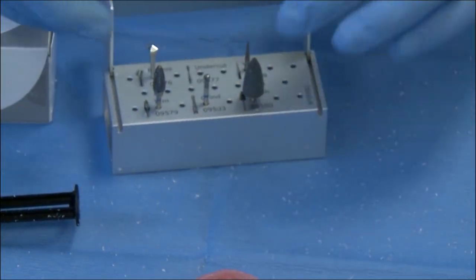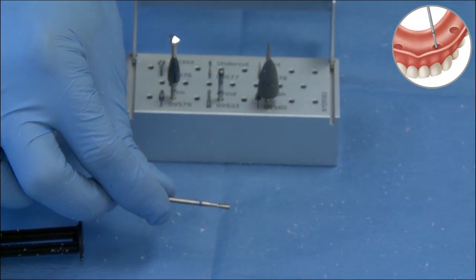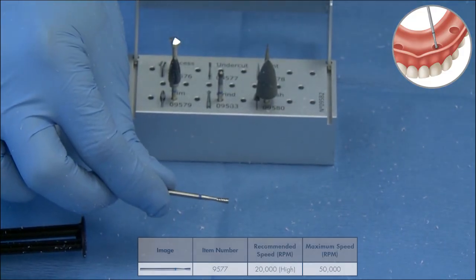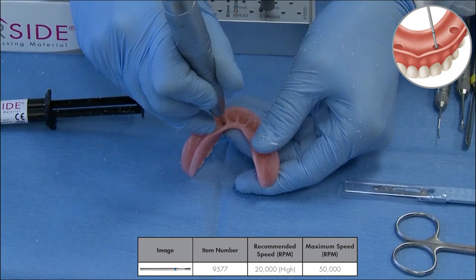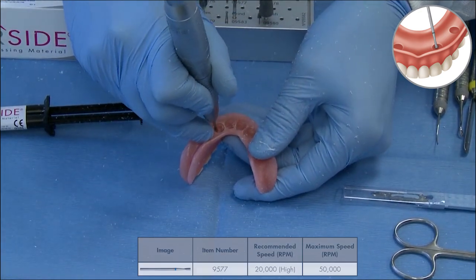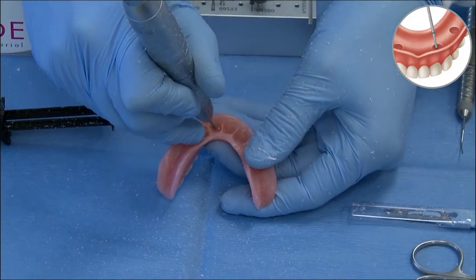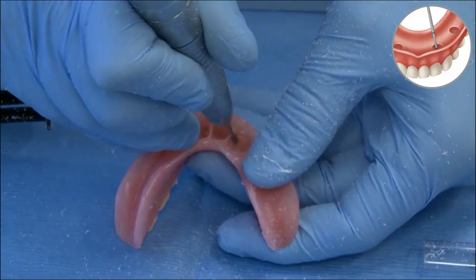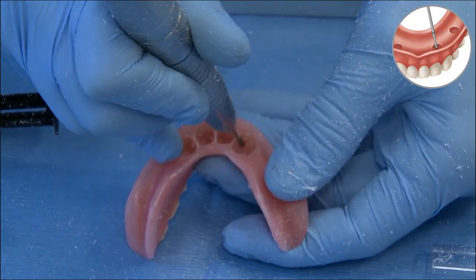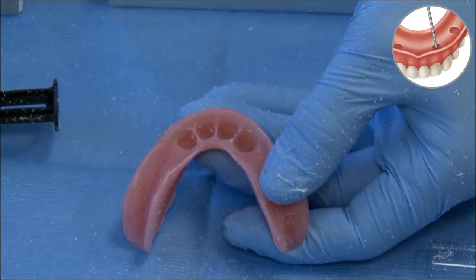Once I've completed using the recess burr, I can take the undercut burr — burr number two in the top portion of the burr block — also run at high speed. The undercut burr is used in a lateral direction on the mesial, distal, and very gingerly on the facial-lingual, creating undercuts — a mechanical undercut allowing the chairside attachment processing material to mechanically bond to the recess portion of the complete denture.